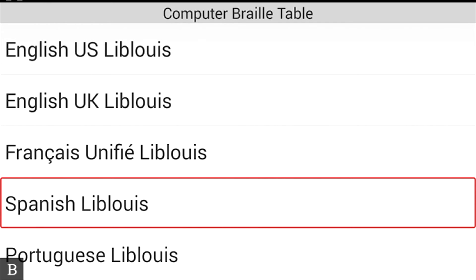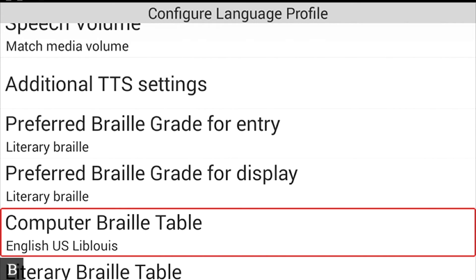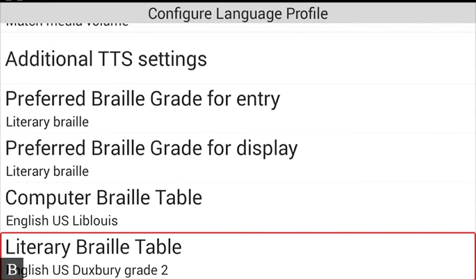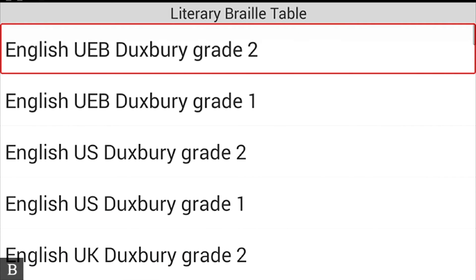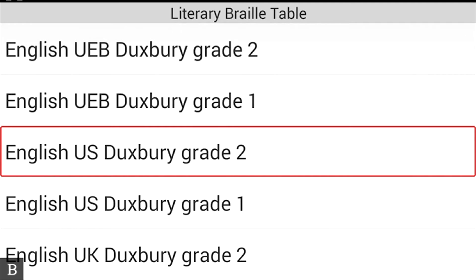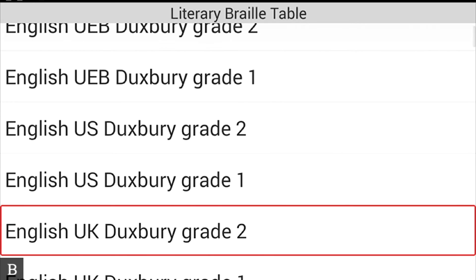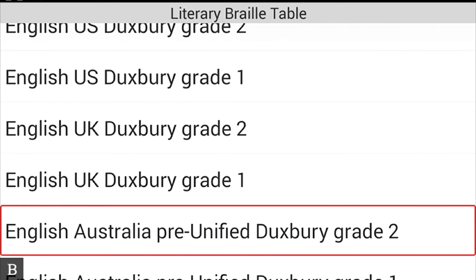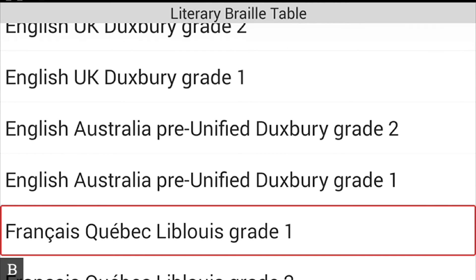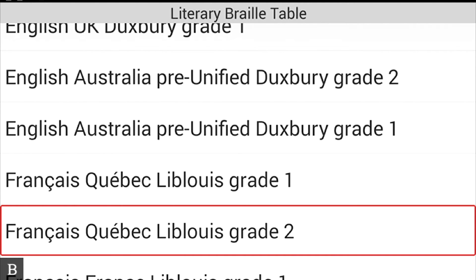The Literary Braille Table is currently set to English US Duxbury Grade 2. You can also choose UEB Duxbury, English US Duxbury Grade 1, English UK Duxbury Grade 2, English UK Grade 1, English Australia pre-unified Duxbury Grade 2, and French Quebec Liblouis Grade 1, among many others. You'll notice a combination of Liblouis and Duxbury tables, because certain languages prefer one over the other.